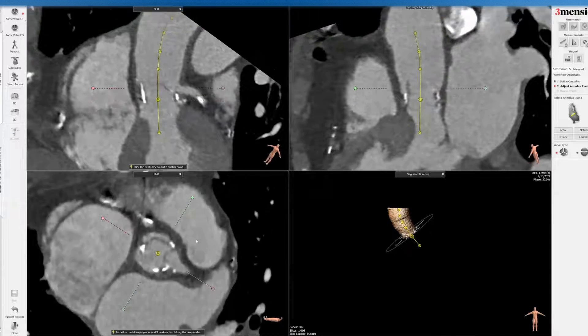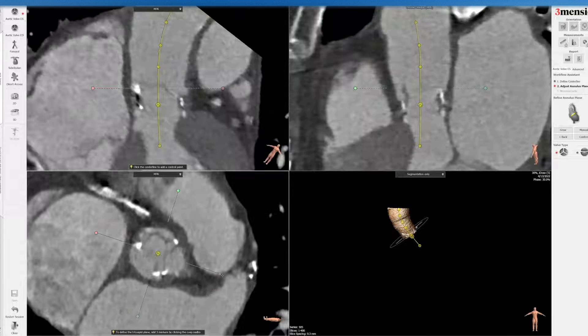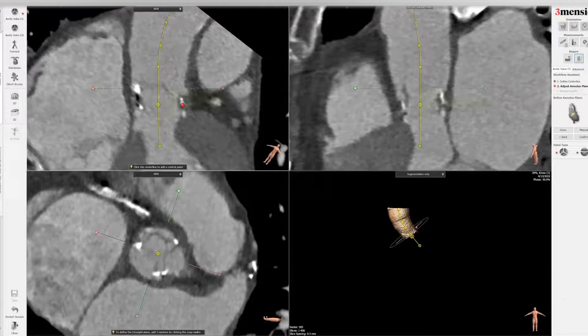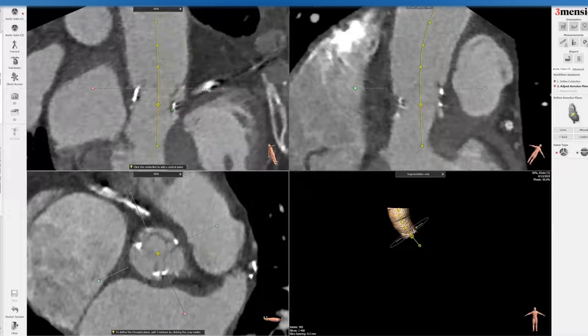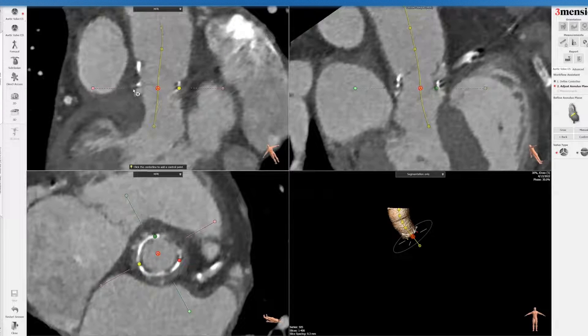Similar to what we've done before in prior sessions, I'm going to line up the open red circle on the bottom left panel with one of the commissure posts. I'm going to put a dot on the top left panel. Next, I'm going to rotate this counterclockwise to the right sinus and put a dot at the base. I'll do that again for the non-coronary sinus, and now you have your three dots.